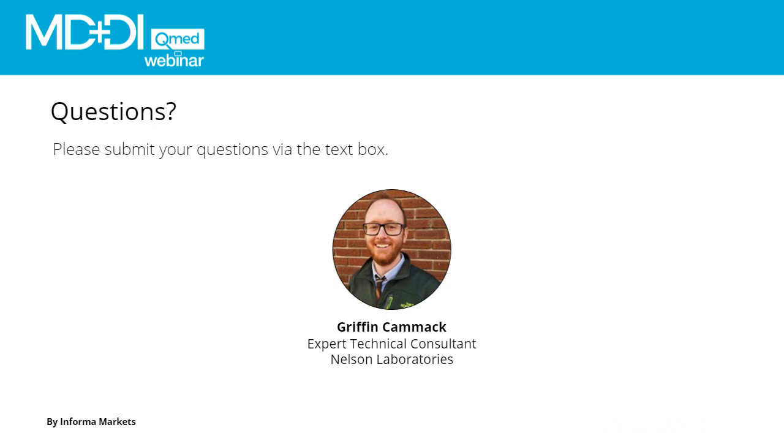Yeah, that is an excellent question. So it is a device that will most likely just come in contact with non-gloved hands, if that's correct. In which case you just want to assess the intended use of the device. Is it likely to become contaminated with blood or other bodily fluids? And if the answer to that question is yes, then you may want to do an intermediate level disinfection. If the likely contamination is no, then a low level disinfection would be appropriate.